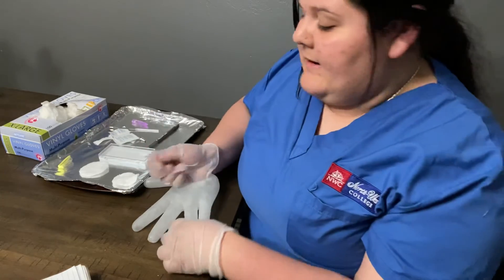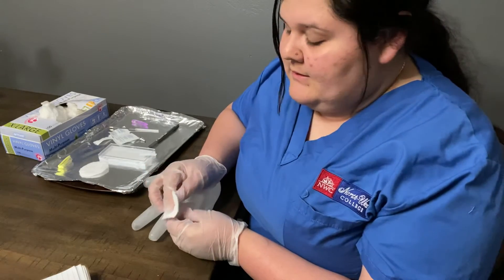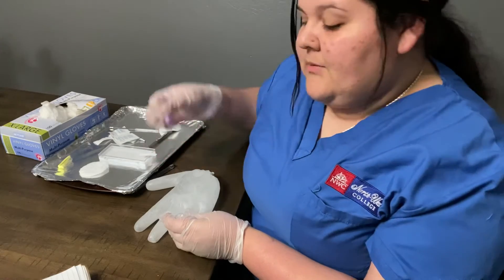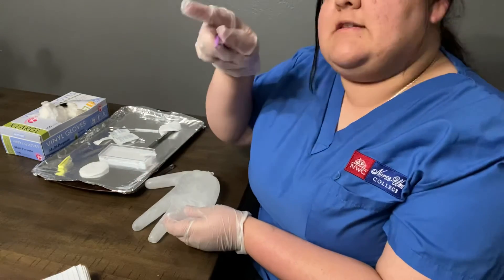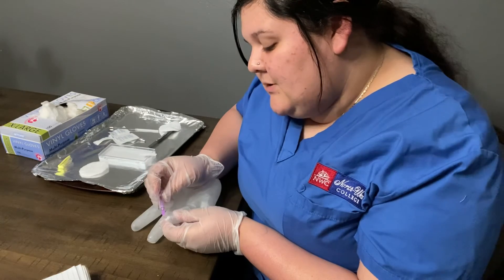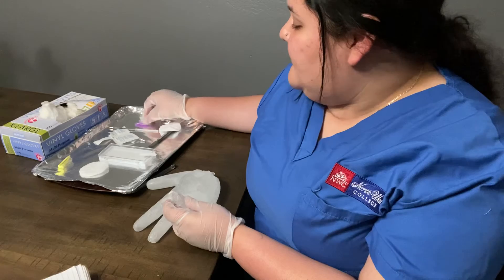Once you do that, you're going to want to squeeze the finger again to get more blood and wipe it. Then you're going to want to get the cuvette and collect the blood. The cuvette is kind of pointed at an angle, so when you collect it, you just want to touch the tip to collect the blood. Then you're going to go ahead and put that in the machine to test.